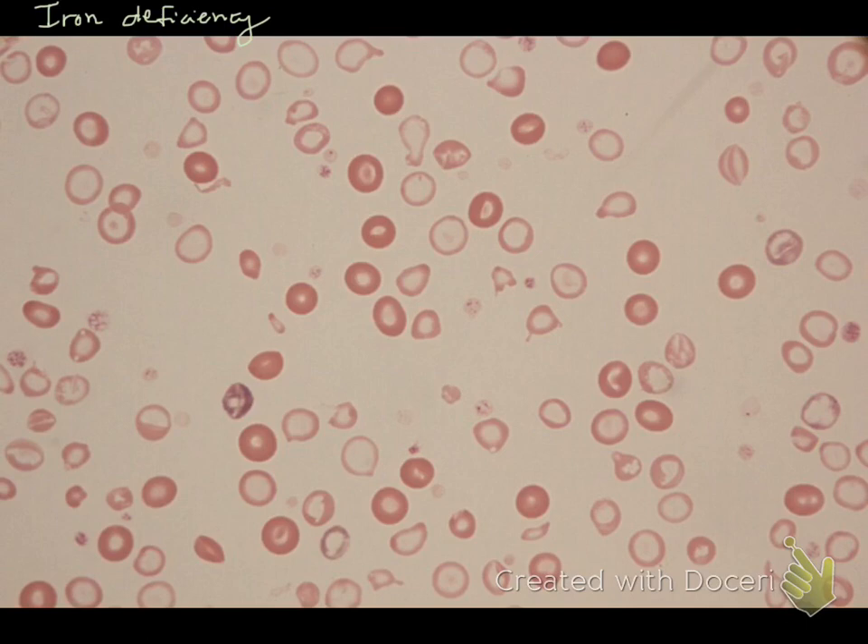A few things you'll notice is that these red cells are very, very pale — they're not ghost cells, but they're very pale red cells. We would call this hypochromasia, so hypochromasia is very pale red cells. There are also numerous microcytes, which are small pale cells.